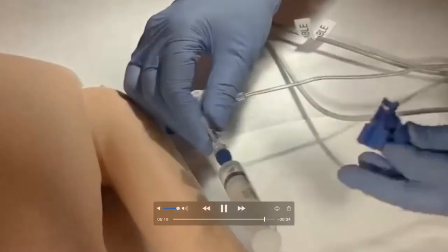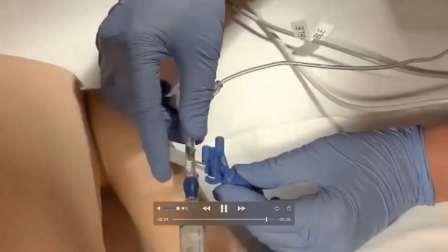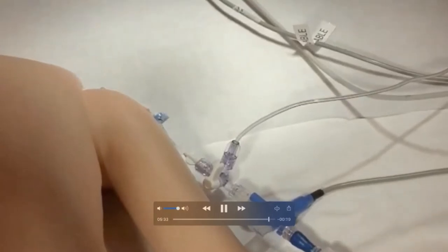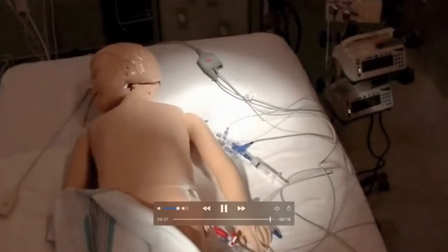I will do it again on the monitor. Sure. So that is how it is. Gently snap in place the blue end of the injectate sensor cable to the injectate sensor housing. And then clamp the line. With this setup, you are now ready to turn on the PiCCO monitor, calibrate, and perform thermodilution. So that is the initial setup, madam.